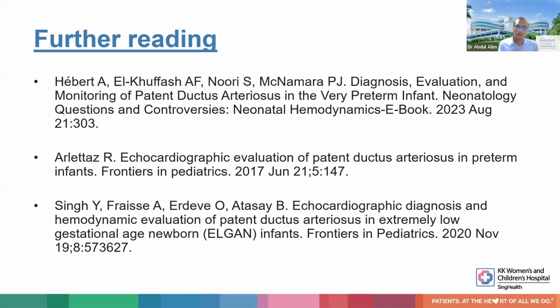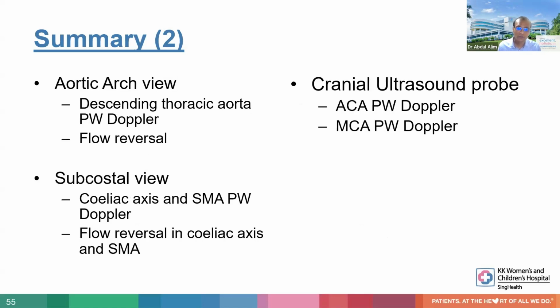Most of the time, what will happen is we will get a good color flow. By the time we put the cursor, our hand might have moved a little bit, and then the image will go off the screen. So we need a little bit of steady hands and a bit of practice. But with practice, it's doable, and it's quite a useful skill to have. And with routine echocardiography, we can target the clinical management of PDA much better, in the diagnosis as well as management, and then we can actually improve patient outcomes. Thank you very much.